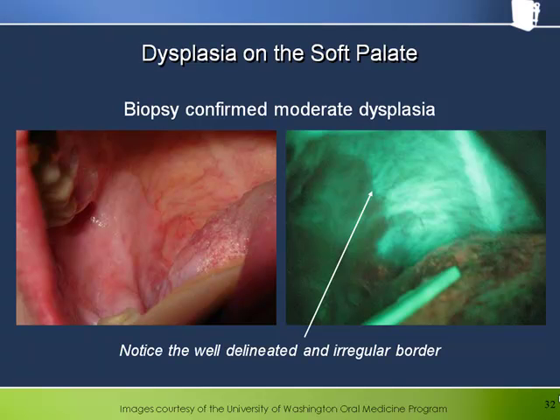It is nevertheless instructive to compare the fluorescence presentation with that under white light. This is a good example of how a white keratinized patch, despite the presence of keratin which fluoresces, can look dark through the Velscope because of the underlying mechanisms of loss of fluorescence — both the decrease of FAD in the epithelium and the breaking of collagen crosslinks in the connective tissue.